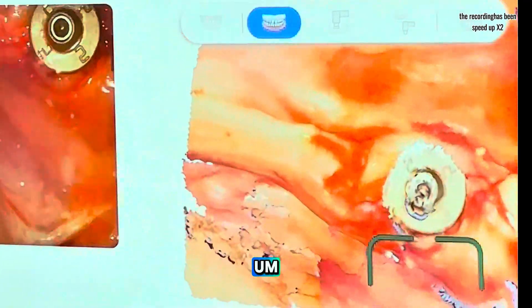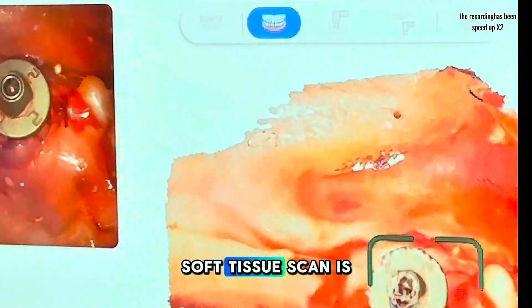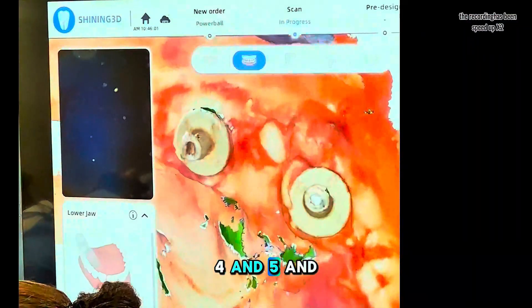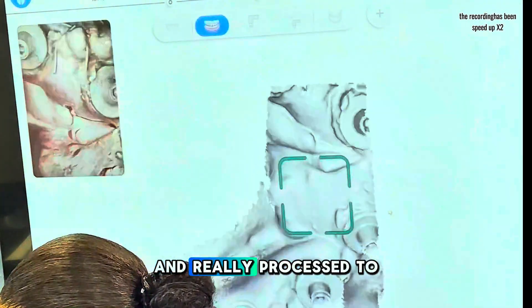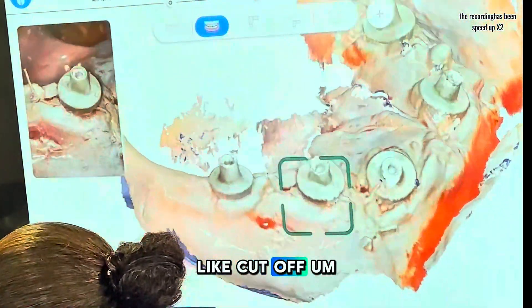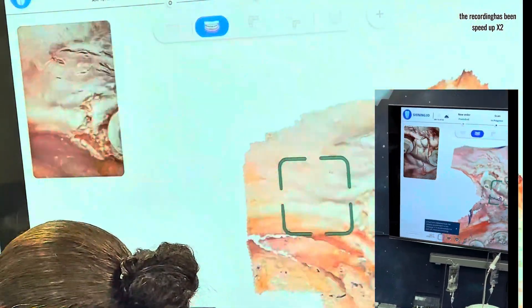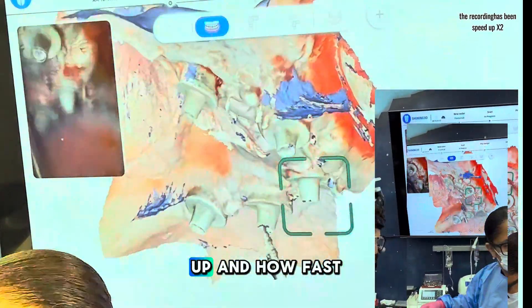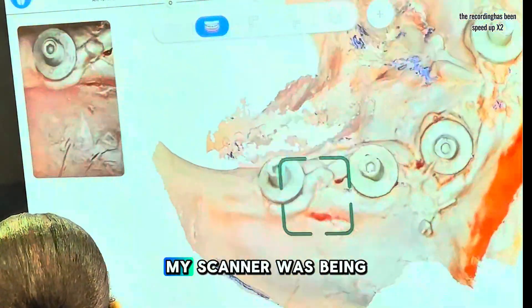In general, with THS caps there's nothing bleeding or blood is very minimal, and the scanner did really well and really fast. The post-processing was done very quickly. I just didn't like how it handled the definition of some smaller parts — that's why I restarted to see if I could get it a little better. I felt the soft tissue scan is not as crisp as it should be. I'm used to Trios three, four, and five where the scan is always strong and well-processed. You can see how the tips look almost cut off. I think they'll probably be able to fix this in a software update.